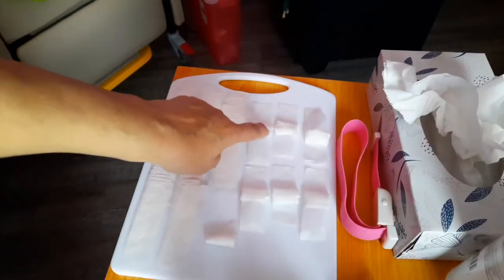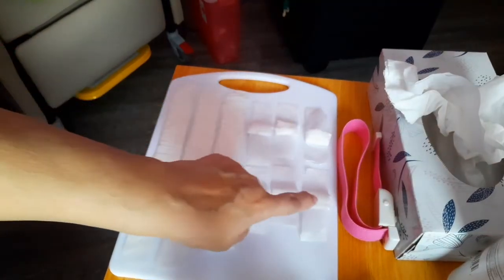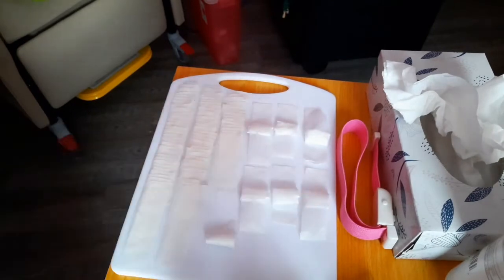Okay, so we have our 6 taped square 2x2s folded in the center. And that's to help stop the bleeding, cover the needles well once it's inserted, and then we pull that out.